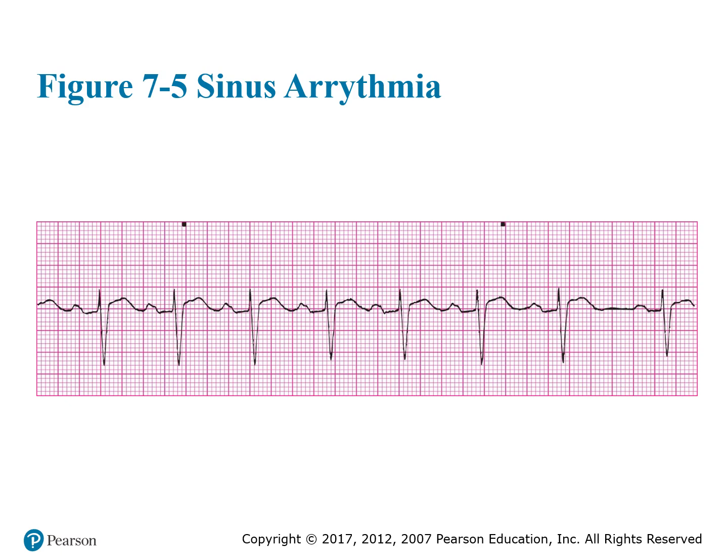Here's a little sinus arrhythmia. As you're looking at it, they've got normal patterns here, a normal spacing, and then right here at the end it widens up a little bit. Still normal QRSs. Nothing's really changed. It's just the distance between the QRSs increased just a little bit here. That is probably associated with their breathing. If you're analyzing an EKG and filling out paperwork, you may want to make a note that there was a slight variation in the rate, but typically they don't do anything for this, and it's not really a treatable issue.